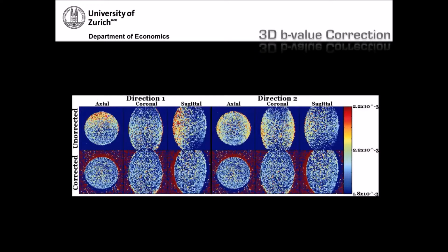In the top left figure, you see that the anterior part has a much higher diffusion constant than the posterior. You might think this is a temperature bias within the phantom, that the front of the phantom is warmer for some reason and the back is colder, just from the ambient temperature, or maybe there is airflow.